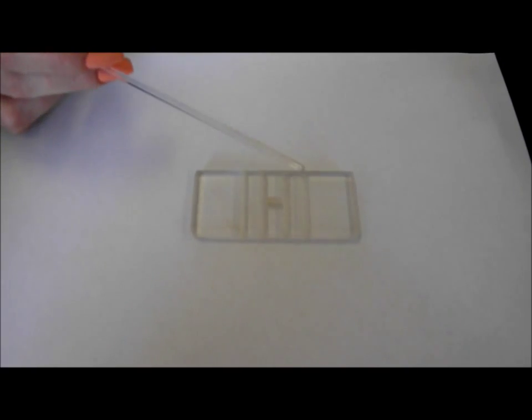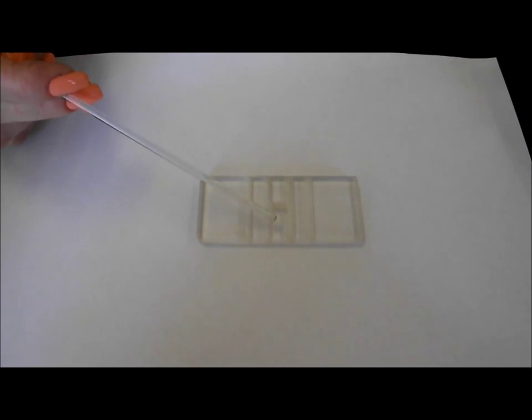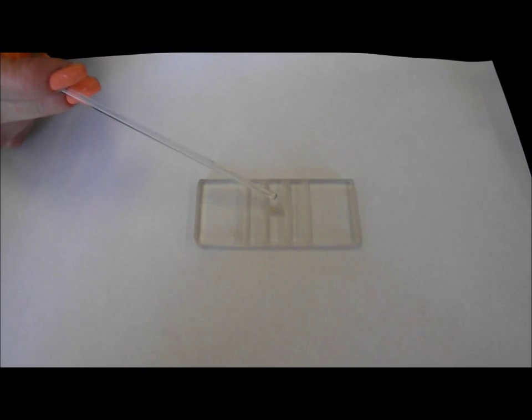The counting chamber is a thin glass plate with 4 troughs in the middle. There are three narrow stripes between them. The middle stripe is 0.1 mm lower than the others and divided with a trough. From the two sides of this trough there are the meshworks of Goryaev.